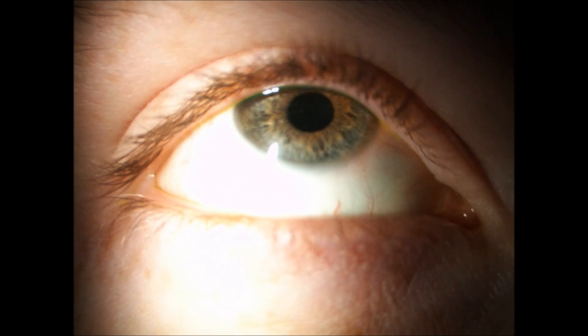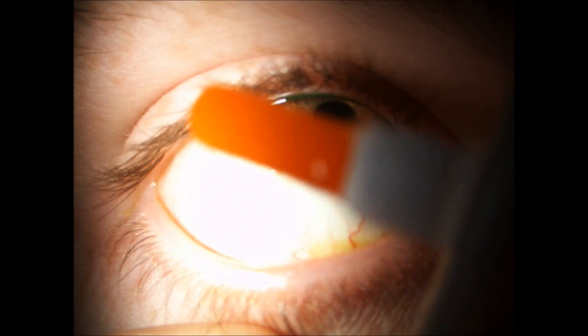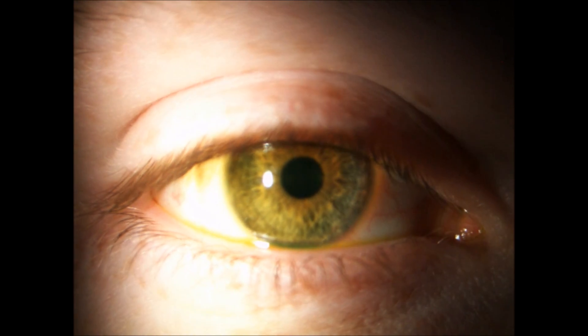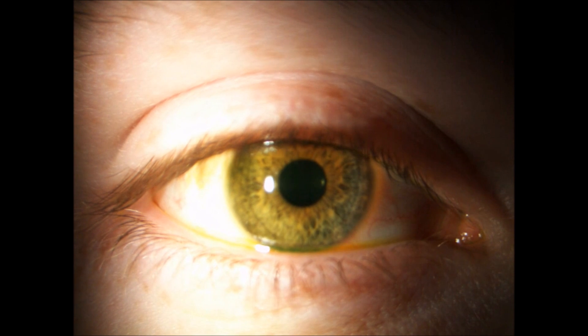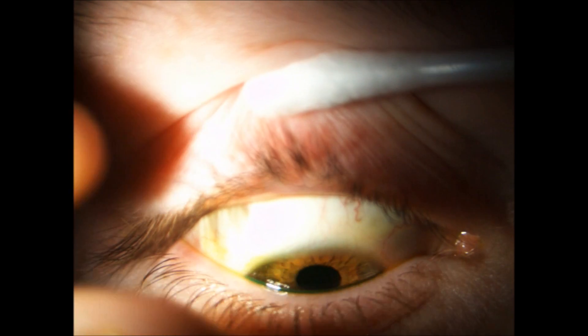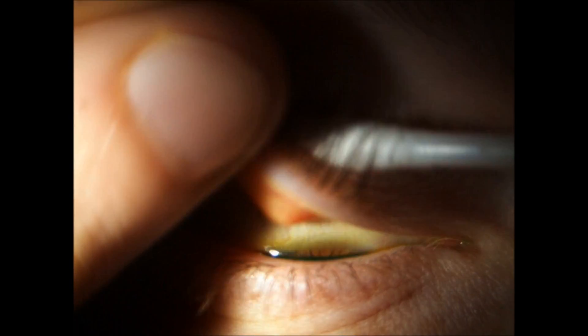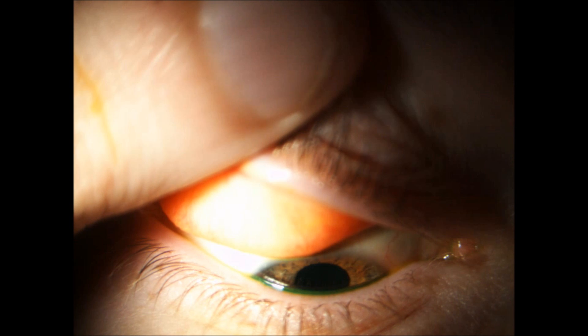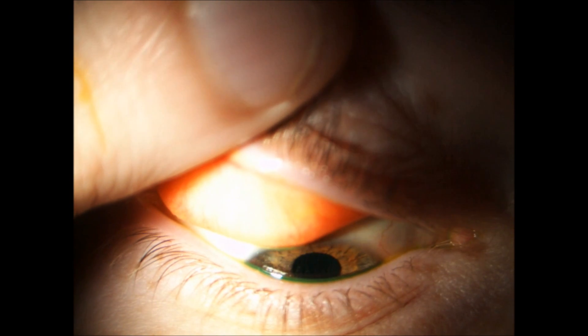If you get the patient to look up — so if you look up for me — we'll bring the lower lid down and then we'll just instill one dab of fluorescein. That should be more than enough. Now get them to blink a few times, just make sure they're nice and comfortable. Now we're going to invert the lid. So if you get the patient to look down, bring the cotton bud up and then just with your thumb, you're just going to bring that down in one fluid motion. Get the patient to keep looking down because this will maximize comfort.